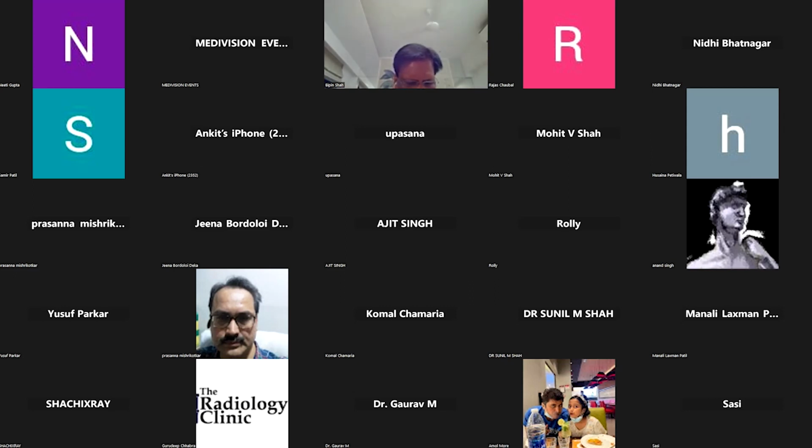They just look at the radiographs and see the boutonniere, and they know there is flexion at the PIP and extension at the DIP, and they know they don't need ultrasound for that. Right. But if it comes to you, at least this is the least you can include in your report: that yes, the central slip is intact or not. At least do that much work. I agree.